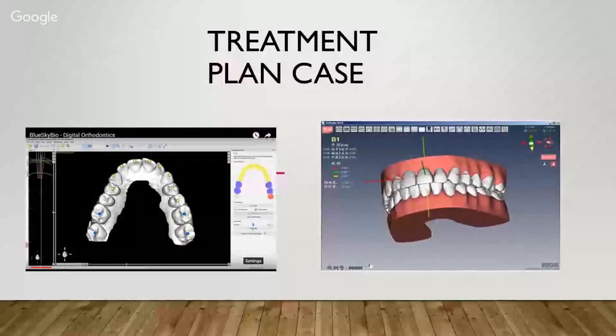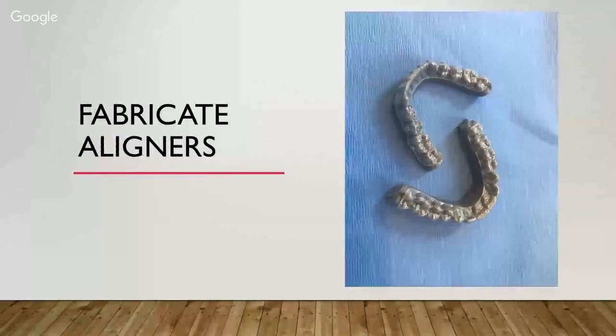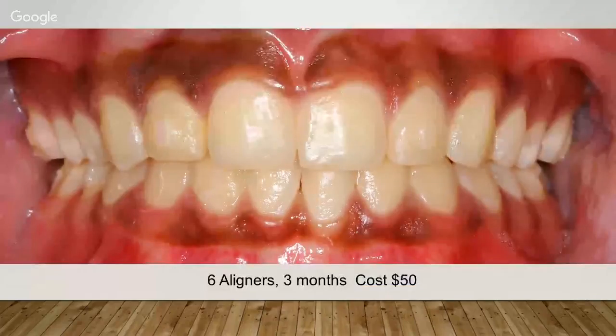And we plan the case, treatment plan the case, print the models, fabricate clear aligners. And this has become such a big part of our practice that we pretty much had to hire somebody just to fabricate these in office. That's a good thing though. And we finished her using clear aligners, 6 aligners, 3 months, cost of about $50. And again, it's an easier process. The patients love it because they're getting out of the conventional brackets and wires earlier. And then these will end up being like their final retainers as well.